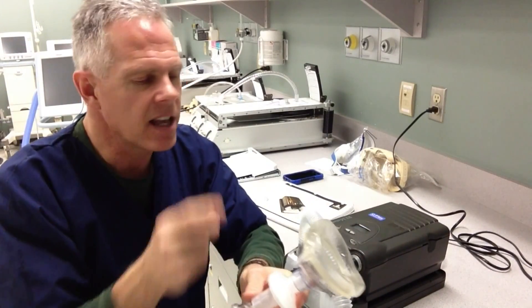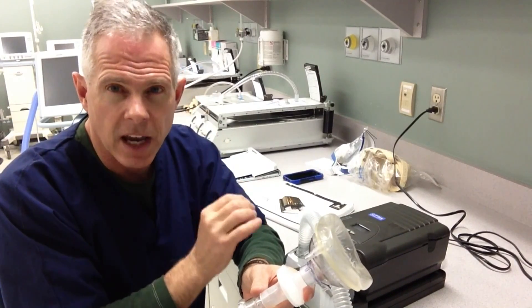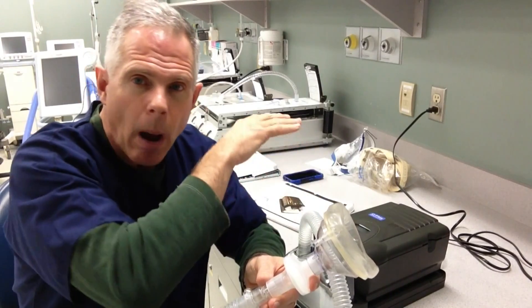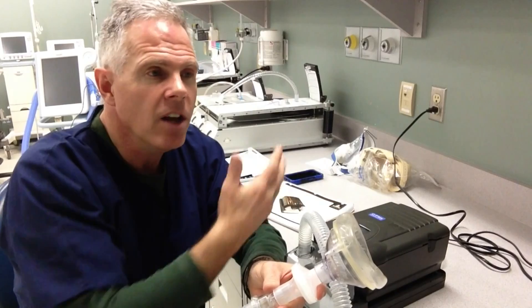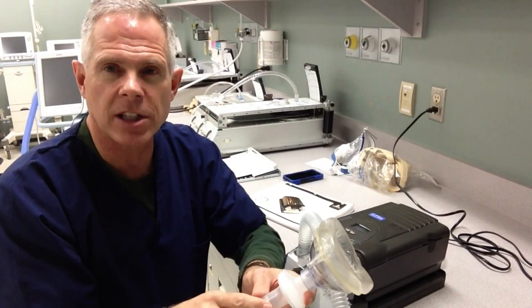This machine is set up to give constant positive airway pressure, or CPAP. Those pressures are going to be adjusted either automatically by the machine so that the patient can maintain an open airway, or set manually by us and established in the machine.